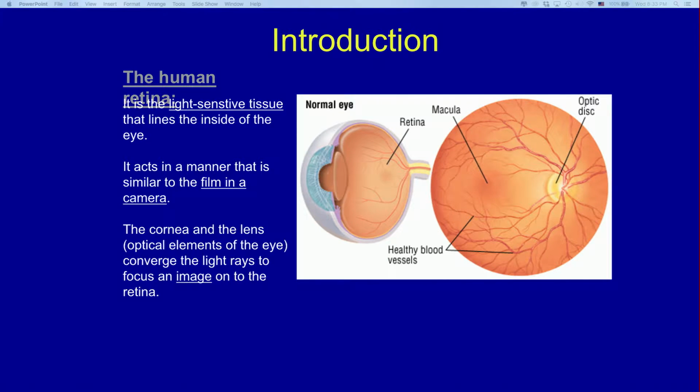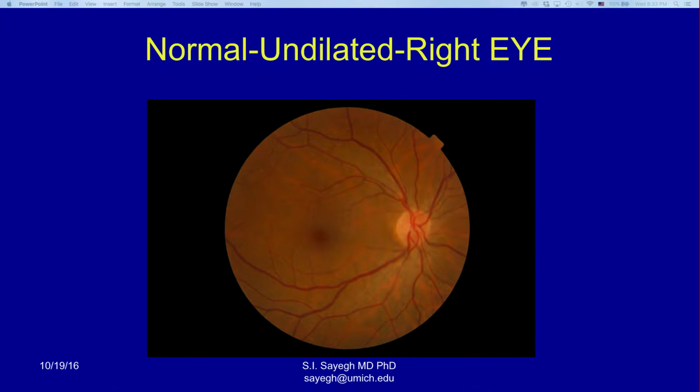Basically, that's where the retina is, in the back of the eye. And when we talk about technicalities, there are a lot of contrasts. So we're going to talk about normal and abnormal. It's still very important to detect normal images. I want to be able to detect normal images, at least to say, oh, this is normal, right?